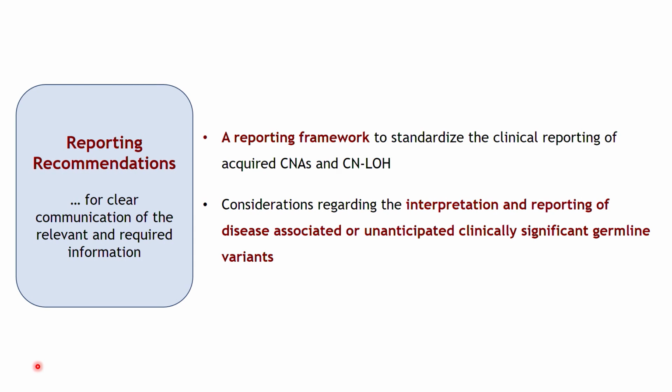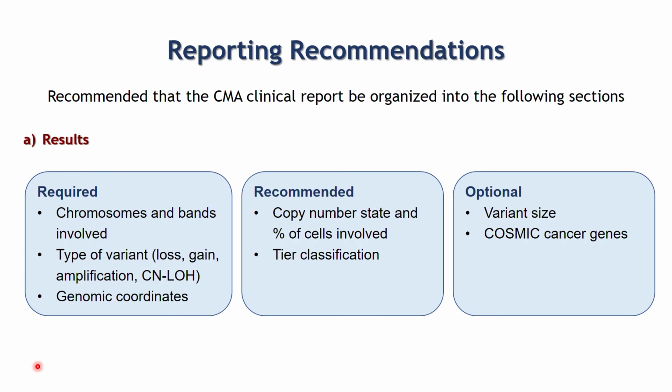We also have some recommendations how to interpret and report disease-associated germline findings, as well as unanticipated clinically significant germline variants. So again, there were questions about this during panel discussion yesterday, and some of the answers are listed. You will be able to find in the manuscript, and we will also show some examples after this talk.